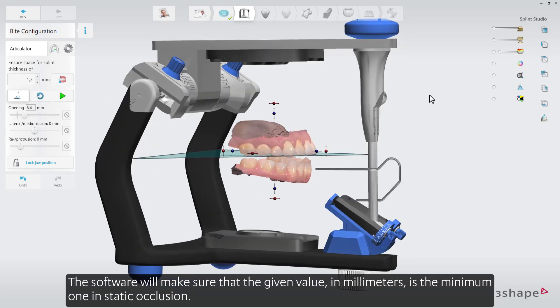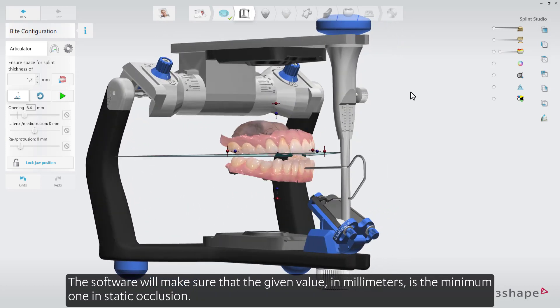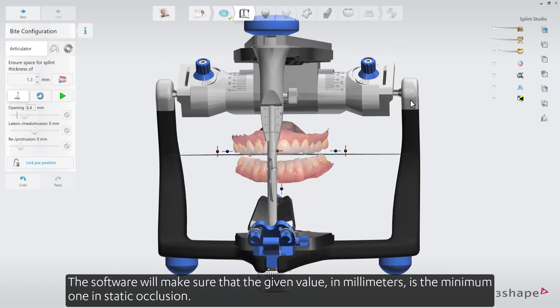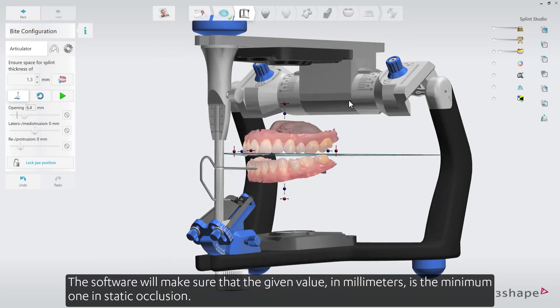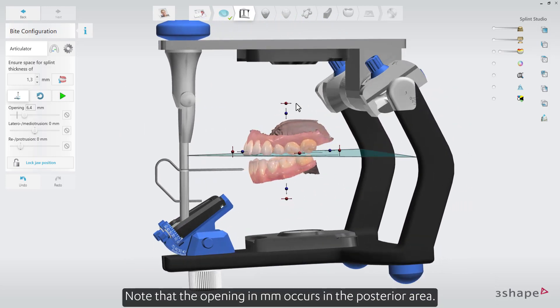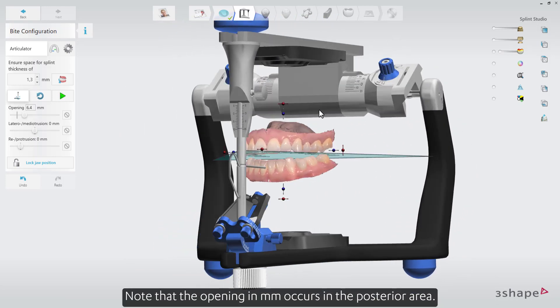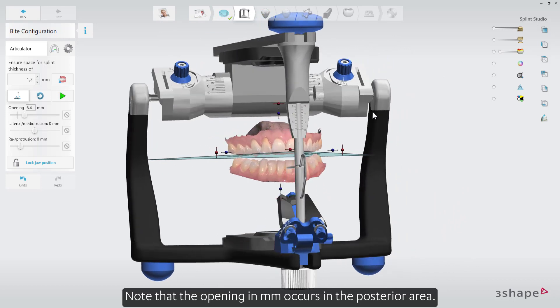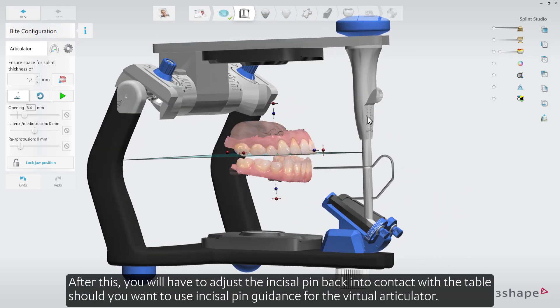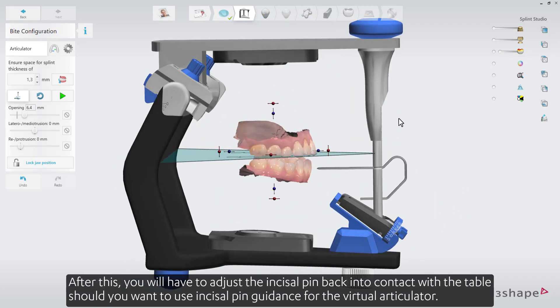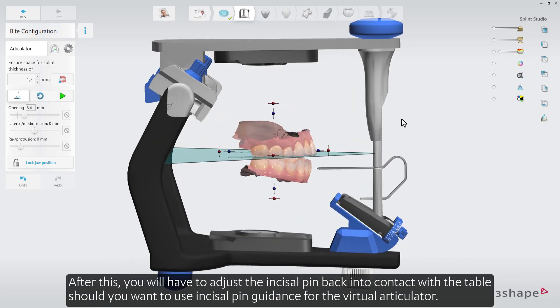The software will make sure that the given value, in millimeters, is the minimum one in static occlusion. Note that the opening in millimeters occurs in the posterior area. After this, you'll have to adjust the incisal pin back into contact with the table should you want to use the incisal pin guidance for the virtual articulator.